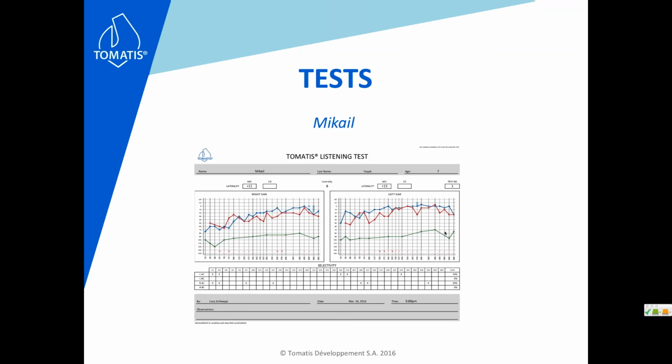That's for sure. But here you see, even if the curve is not too low either, because you can have curves which are lower, the sensitivity on the listening level is there. That's for sure. Yes, and selectivity is closed, and laterality was an 8. Yes, laterality is right-eared, and the resistance is not too good.